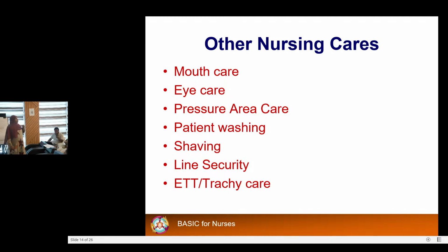That is very important. Una remove ile inner cannula, unasafisha and then unarudisha. Na unapoitoa ile unahakikisha kama ndani ile iko fenestrated or no. Kama iko fenestrated, unabadilisha kwa ile ambayo haiko fenestrated, ndio unafanya suction.